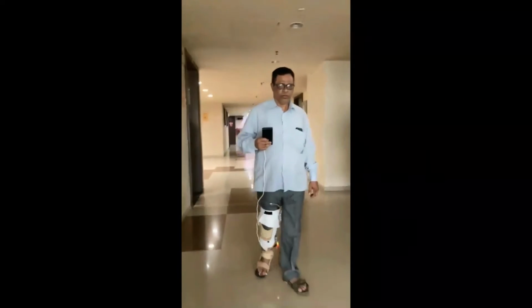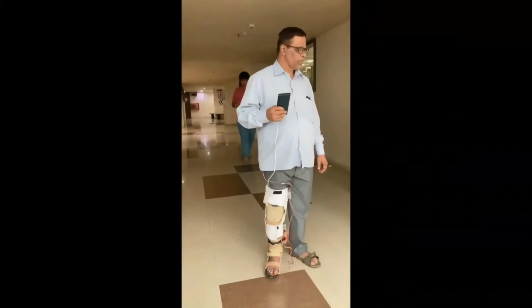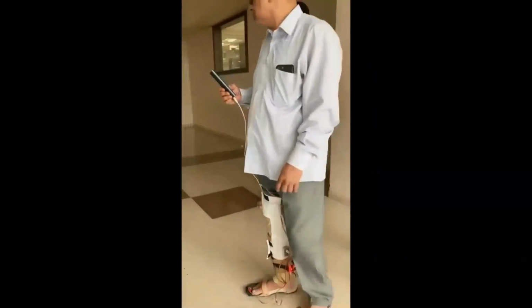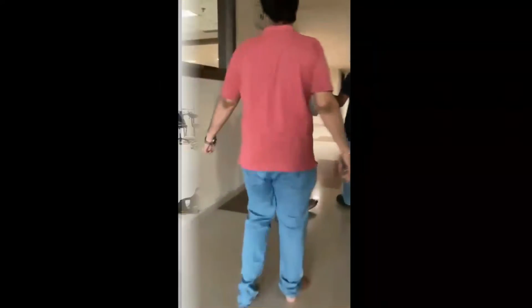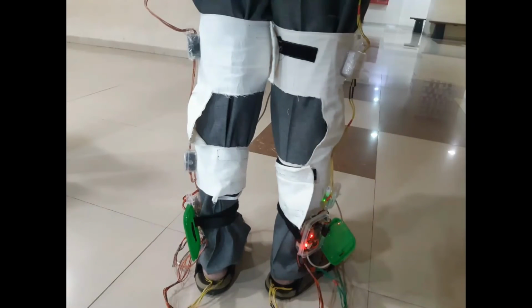So this is our hardware part. As you can see, we have applied our device on a patient. He has some ankle problem. In this case, the patient has to walk for around 10 seconds for the data to get recorded, and the recorded data is sent to the cloud server.